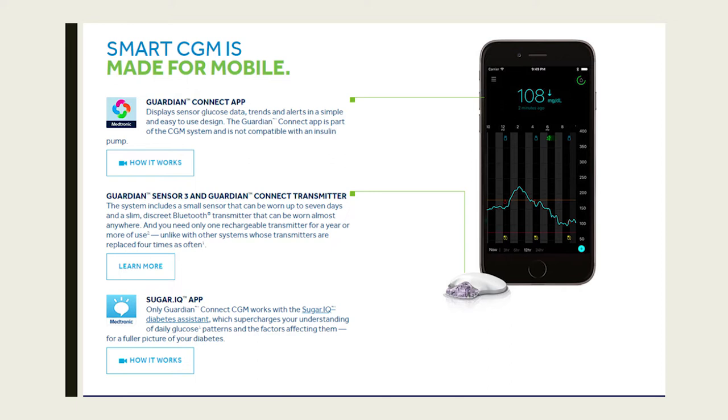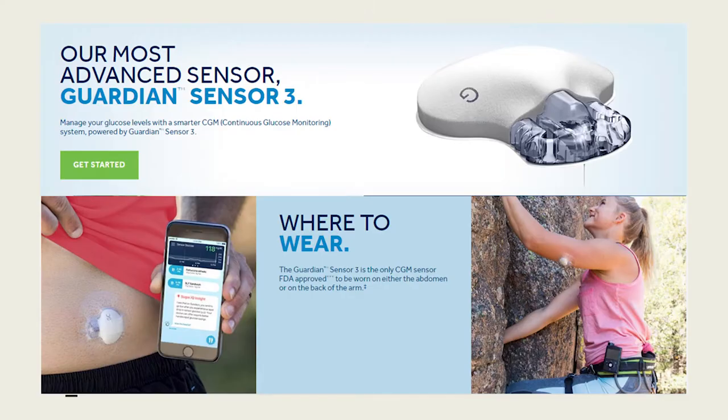It also has some remarkable changes in software, and one of these is the Sugar IQ app. It's just another feature to help people with some of the many decisions that come in the day in the life of somebody with insulin-dependent diabetes. They are approved for wear on the stomach and the arm. So I didn't talk about accuracy.